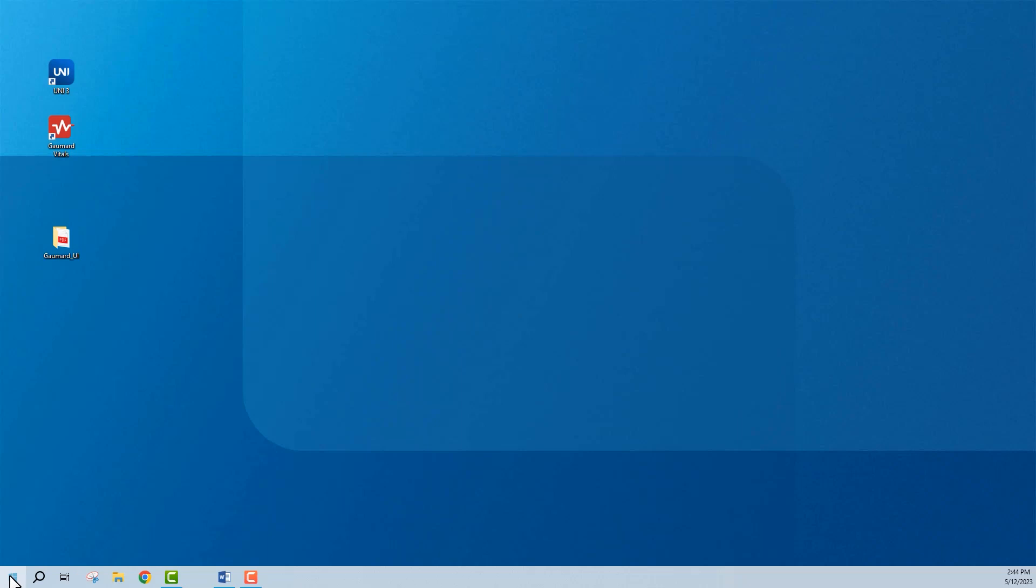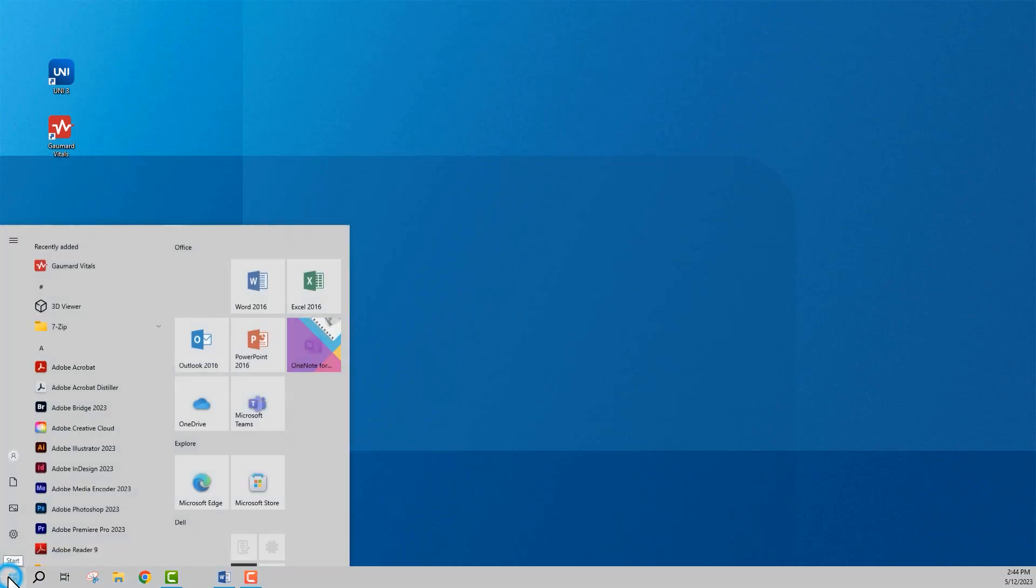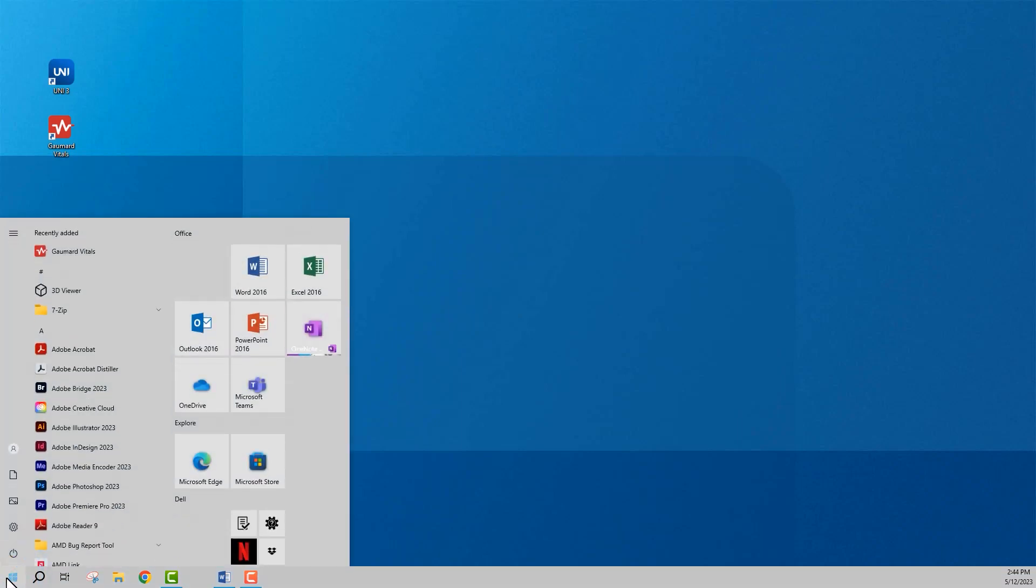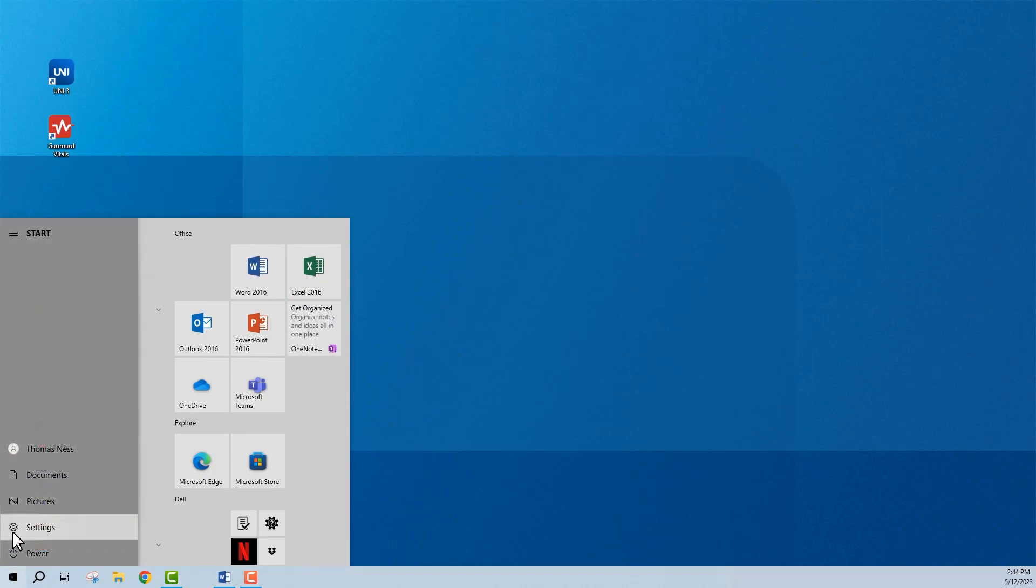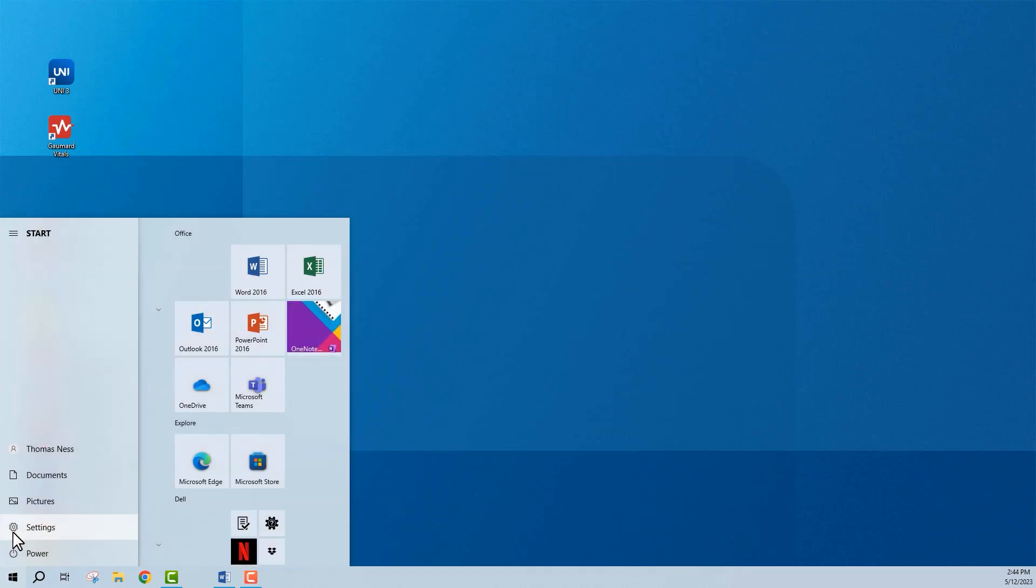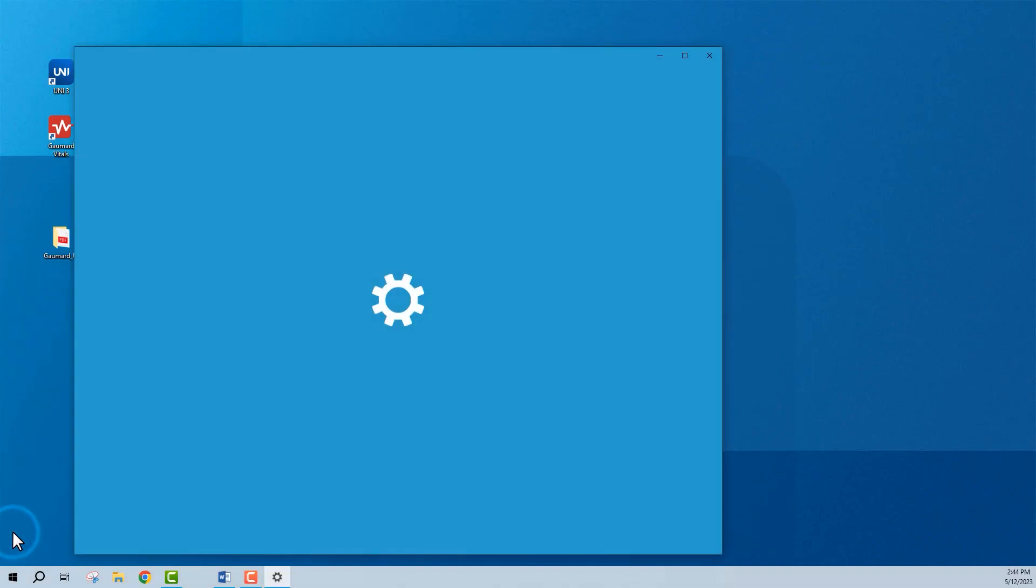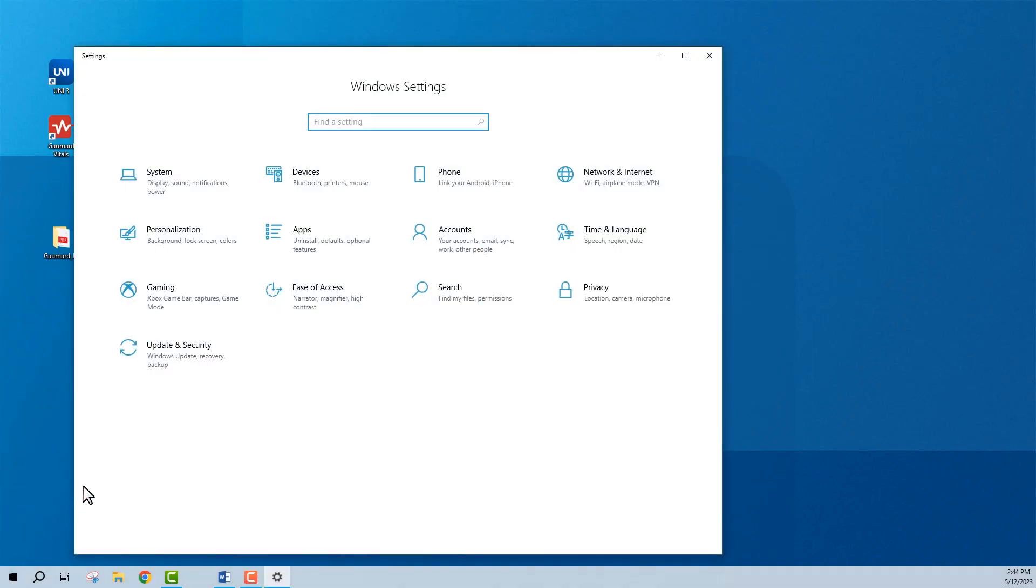Begin by opening the Start menu on your Uni3 computer. Then, open the Windows Settings menu. Next, select Devices.